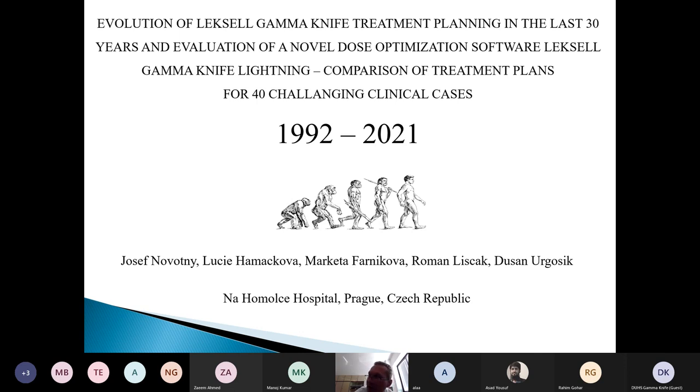And I was getting those phone calls, like, what should we buy? We have a project, we have money, we have a budget, so what should we buy? I think the question you should ask is what you're going to treat, what will be your patient spectrum. Also in Dallas, Texas, where I worked for 1 year, we had a CyberKnife next to a Gamma Knife. So we were 100% objective. We could actually choose. No one was dictating to us. Should we treat the patient on Gamma Knife? Should we treat the patient on CyberKnife? And I think the most important thing is to ask what sort of patients we are going to treat.